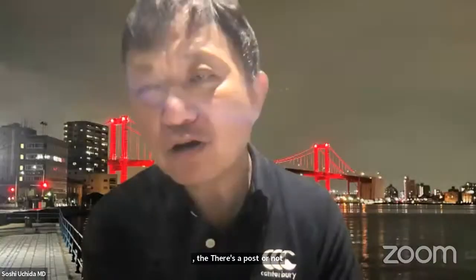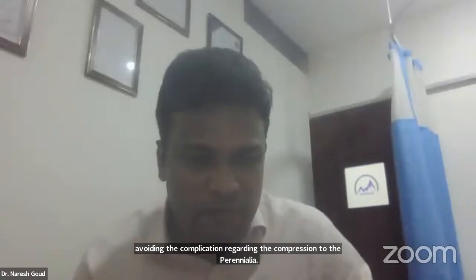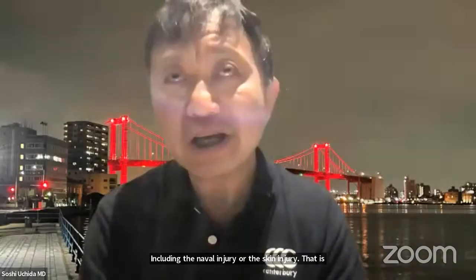I mean, the big difference is whether there is a post or not. In terms of complications, the advantage of a postless system is avoiding the complications regarding compression of the perineal area, including nerve injury or skin injury. That is the main difference. And also, what is the disadvantage of postless?